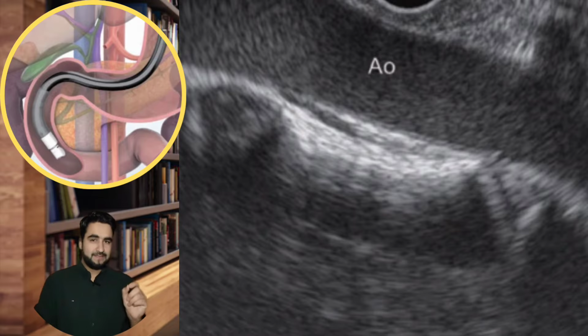You can see my transducer is facing posteriorly and leftwards towards descending aorta. If you have watched my previous videos, you can see aorta in the range of tip beam, central beam, as well as shaft beam. That's why you can see aorta as a large anechoic structure extending from left to right of the EUS screen.